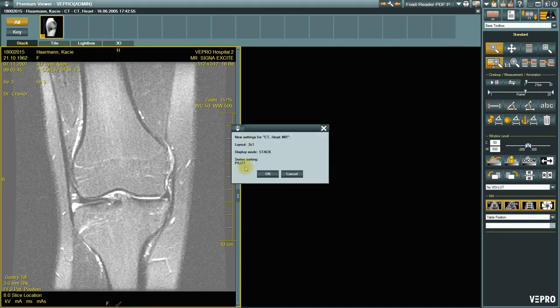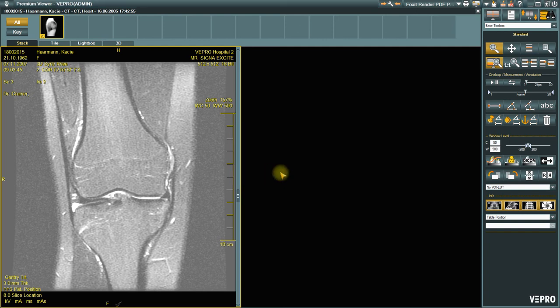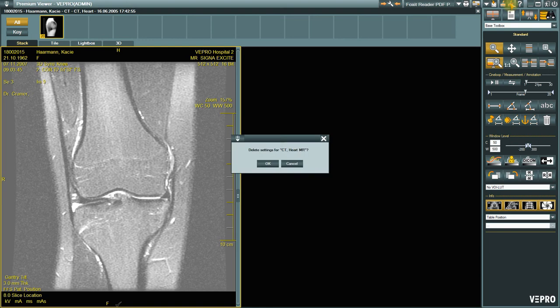You can also remove this again at any time using the Delete Custom Hanging Protocol button. Thereafter, the series will be opened again using the globally configured hanging protocol.